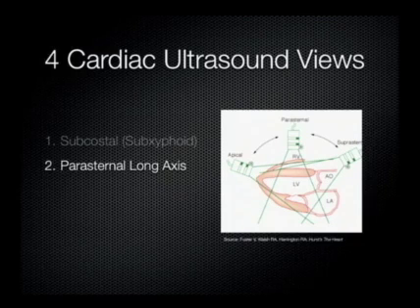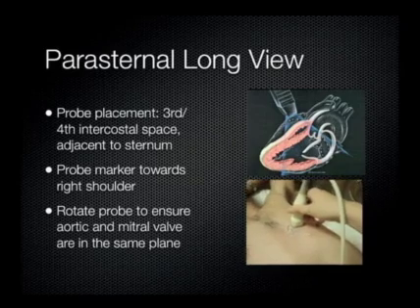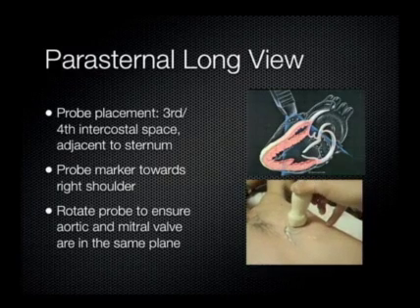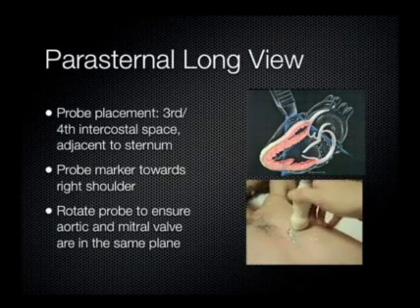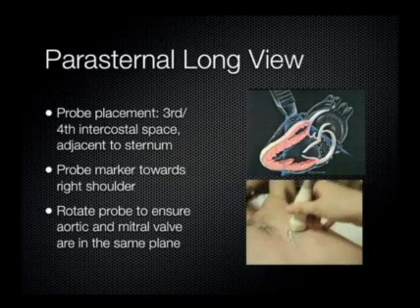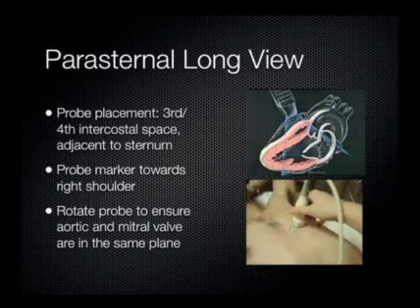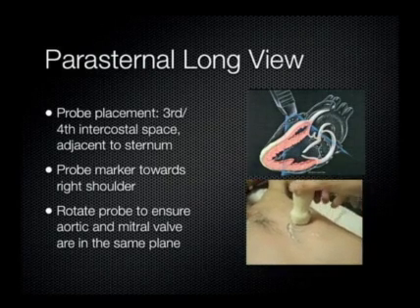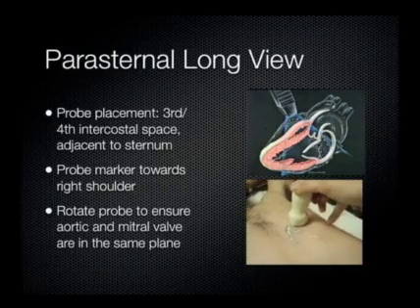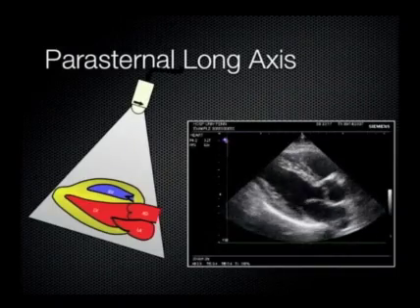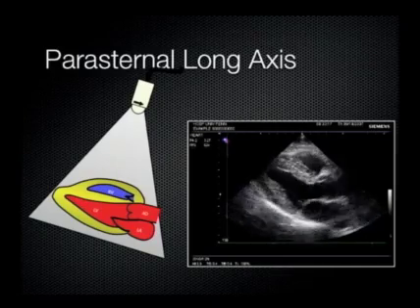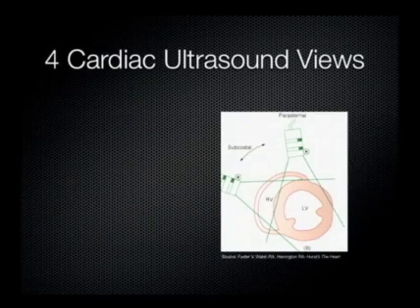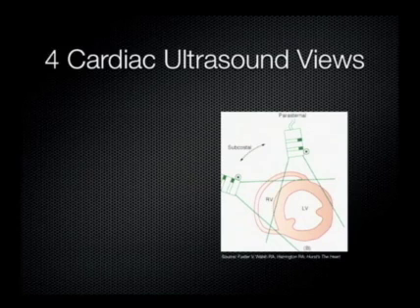Now let's discuss the parasternal long axis. Personally, I think this is the easiest view to obtain. You want to place the probe perpendicular to the chest wall in either the third or fourth intercostal space left of the sternum. For this view, you want to keep the probe perpendicular, as opposed to the subcostal view where we kept the angle low to the chest, and point the probe marker to the patient's right shoulder. Better views can be obtained if you keep the patient towards his or her left side. You want to rotate the probe so that the aortic and mitral valves are in the same plane. For this view, you'll be able to visualize the left ventricle, the right ventricle, interventricular septum, mitral valve, and aortic outflow tract.